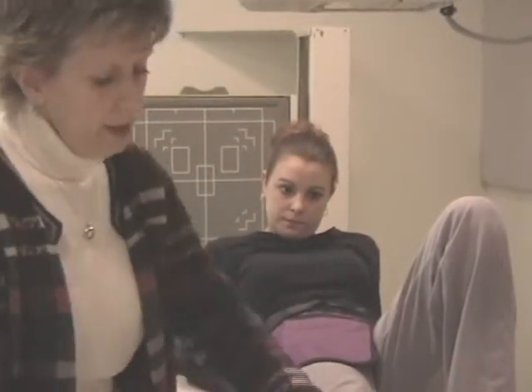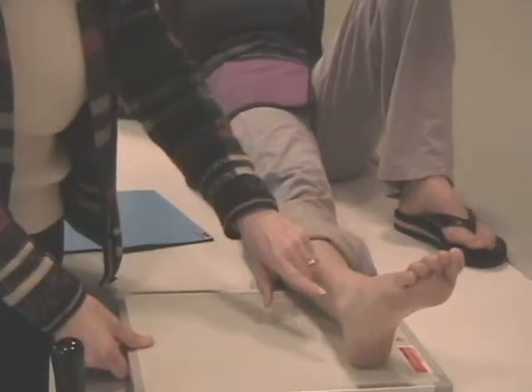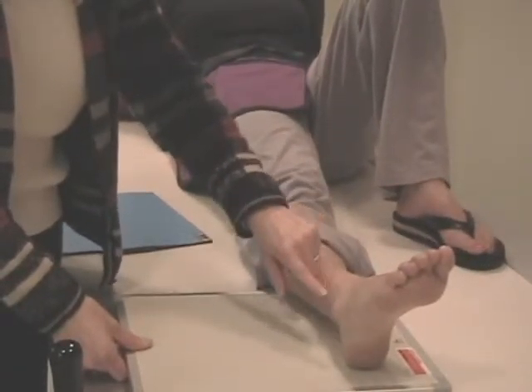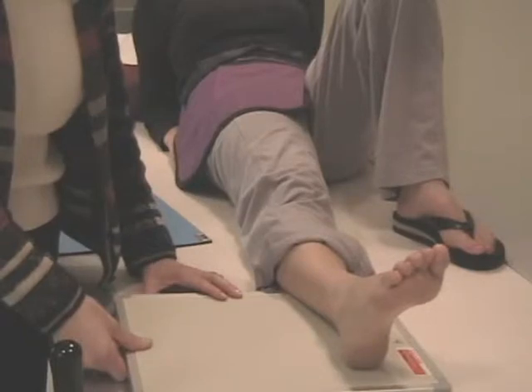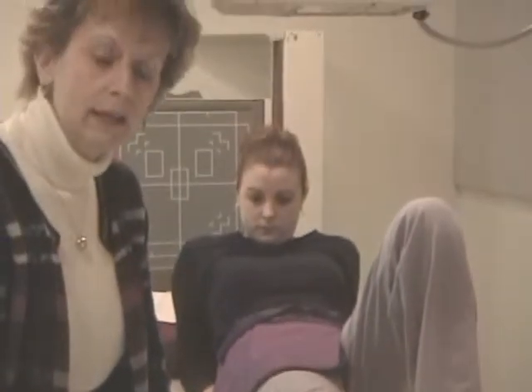In opening up the mortis joint, the fibula will have a space between the fibula and the talus. Usually the fibula is slightly superimposed over the tibia, but the space between the fibula and the talus is definitely open if you've done a good job with the intermalleolar line parallel, approximately a 15-degree oblique.